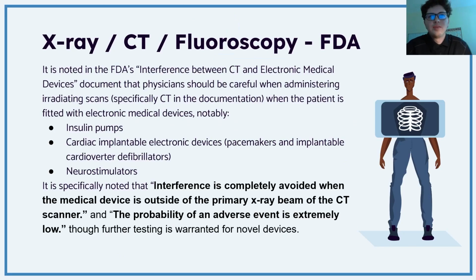So moving away from MRI, we got the X-ray, CT, fluoroscopy. I kind of bundled these due to the ionizing nature of them. We'll also talk about SPECT and PET, but that's later.